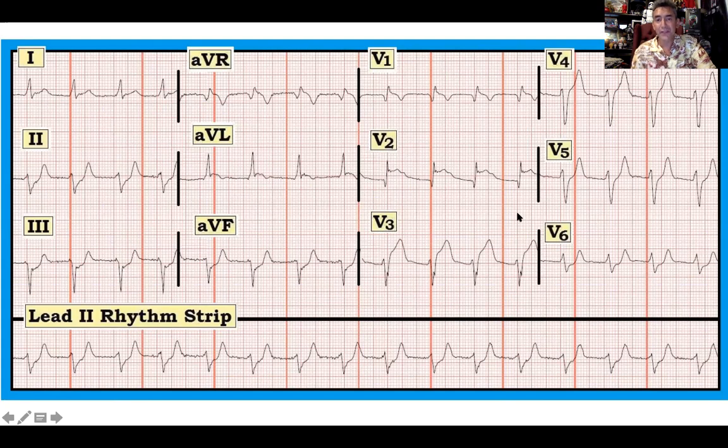So the 12 lead. All of these provide information. The one that gives us the best view of the common waves, analyzing the trajectory from atria to ventricle, would be lead 2. So this is that little section in time that we're going to focus on, lead 2.